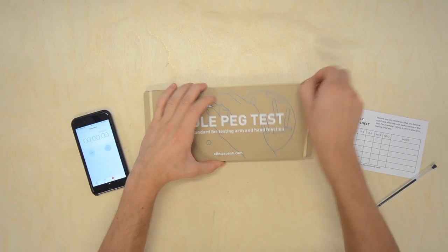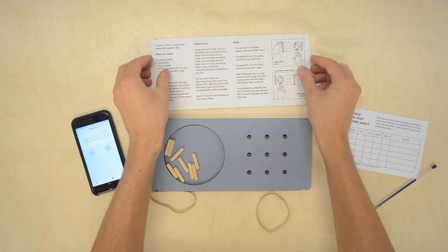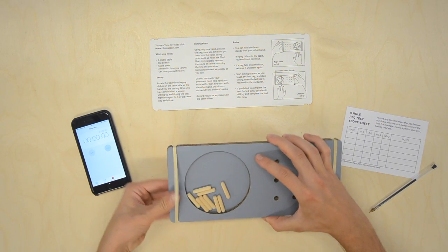You can ask a friend to time you, or you can time yourself if you are able to. Remove the lid and refit the elastic bands. This will give the board extra grip on the table.